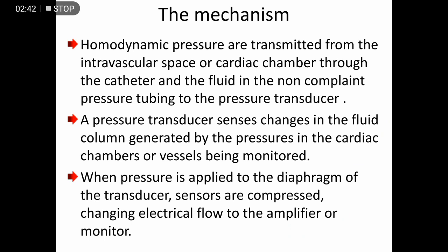The mechanism of the transducer: hemodynamic pressures are transmitted from the intravascular space or cardiac chamber through the catheter and the fluid in the non-compliant pressure tubing to the pressure transducer. A pressure transducer senses changes in the fluid column generated by the pressure in the cardiac chamber or vessel being monitored.